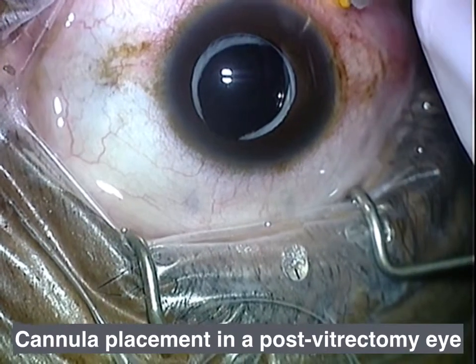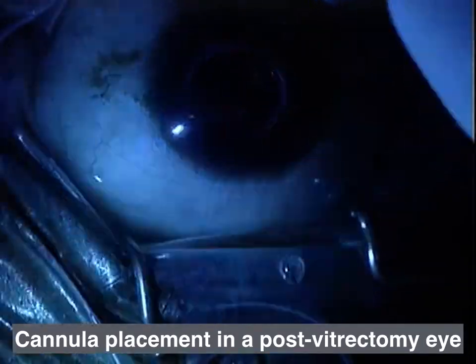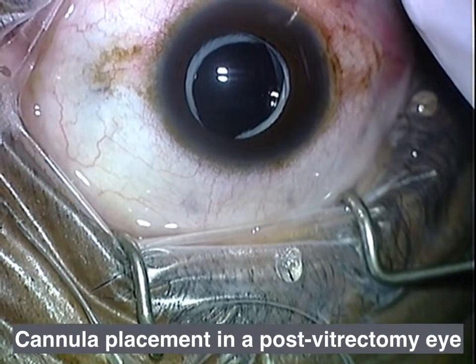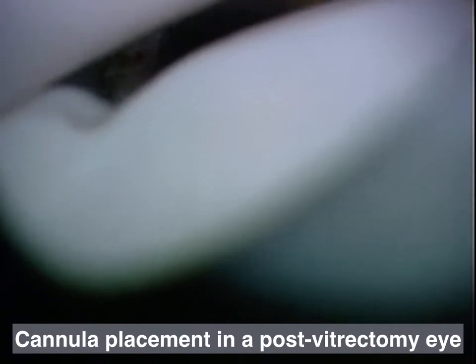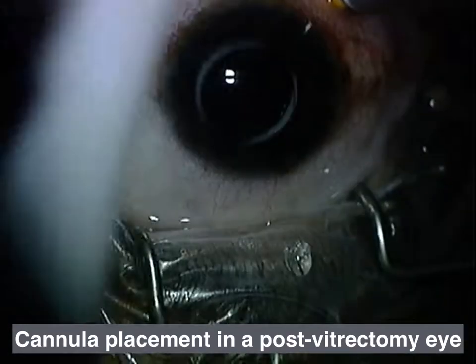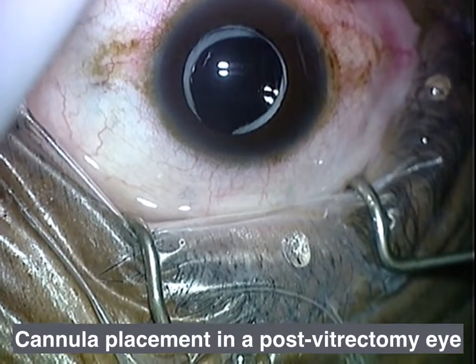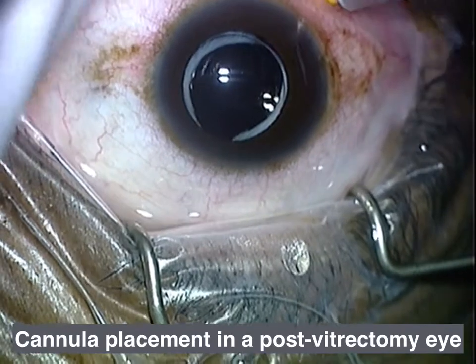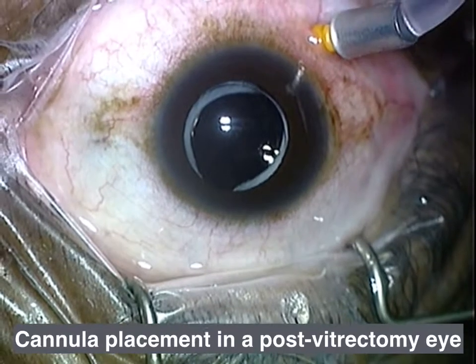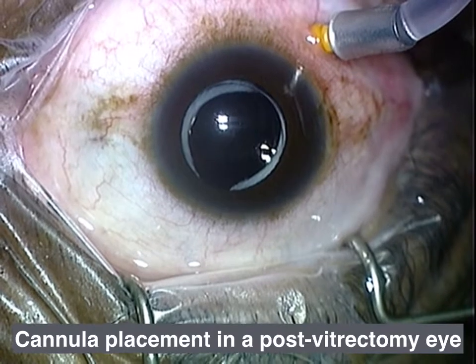Now I know that eye had a vitrectomy in the past. I've expressed more fluid through the infusion cannula to make sure there are no air bubbles, and I turned it off. Now I'm placing — I use my 0.12 to stabilize the cannula. Turning off the light, I use an external light pipe to verify off-microscope the placement of the cannula before I turn on the infusion. I personally just do it externally and have not had any problems with that. I just turned on the infusion now. I'm taping the infusion line in place, and now I'm getting ready to place my superior temporal cannula.